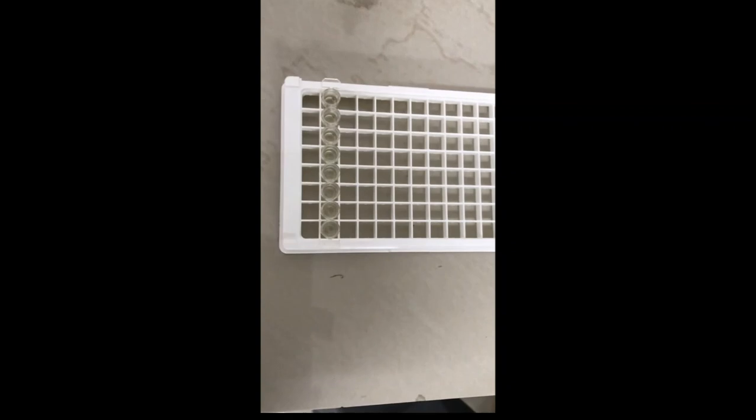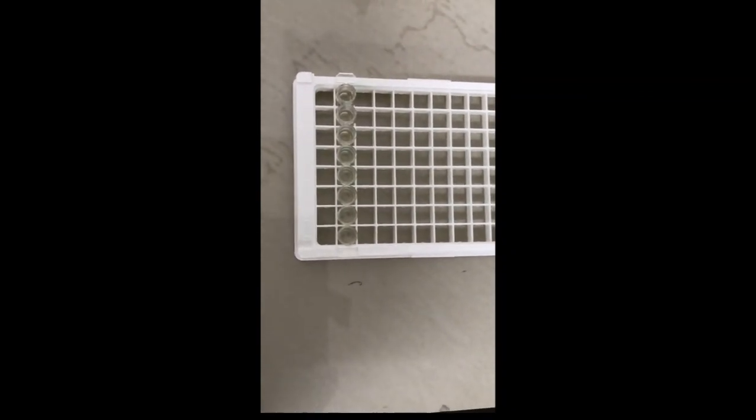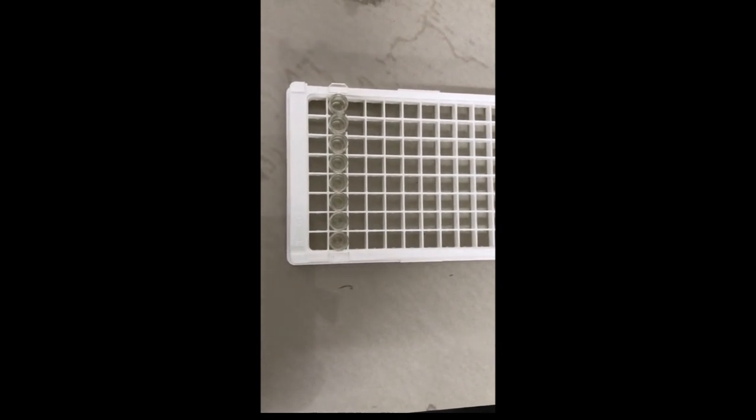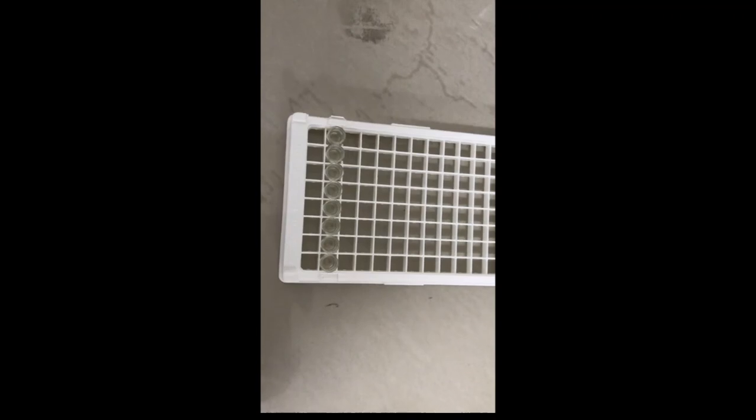After 15 minutes, now we are going to add 50 microliters of stop solution into each of these wells. This is the stop solution for TSH. We are going to use 50 microliters for each.